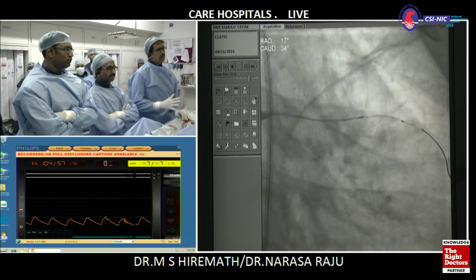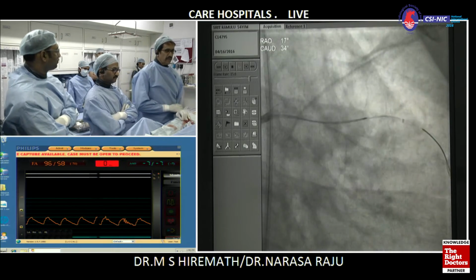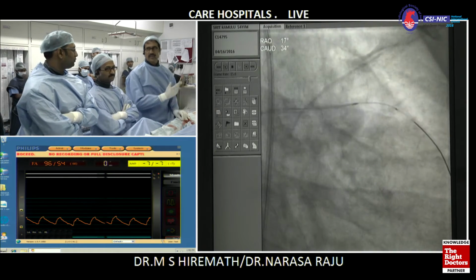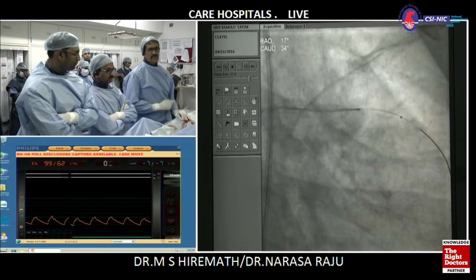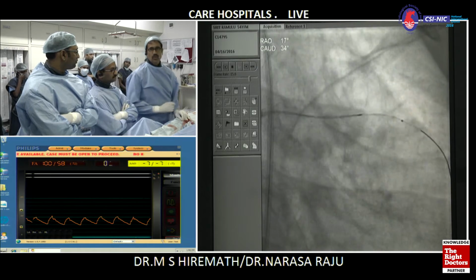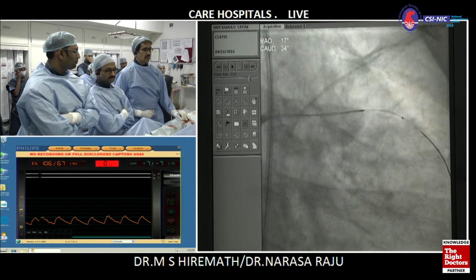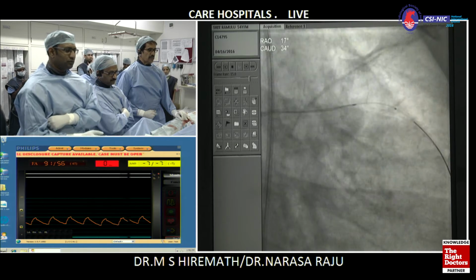See, a few points here are whether there is disease at the mouth of the side branch. Secondly, the diameter, whether the stent is going to really match the diameter of the left main, especially at the back end, and how we are going to achieve the diameter. Today, our largest post-dilatation balloon is only 4.0, so we have to think how we can ultimately match the diameter. So we'll run the IVUS for you. Can we run the IVUS?